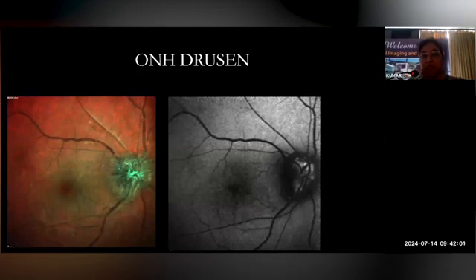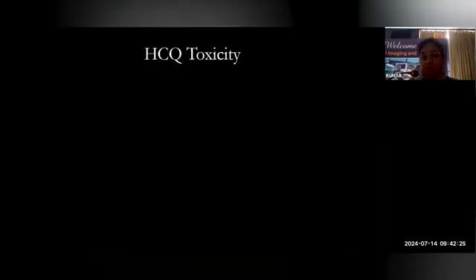An important application is ONH drusen. If we see the color fundus picture on the left side, we would normally diagnose this as optic disc edema with blurred disc margins. However, a simple tool like fundus autofluorescence shows us the hyper-AF from the hyaline or collagen deposits of the drusen. Even buried optic disc drusen can be diagnosed better with autofluorescence as compared to ultrasonography.